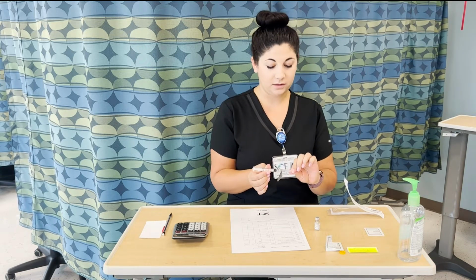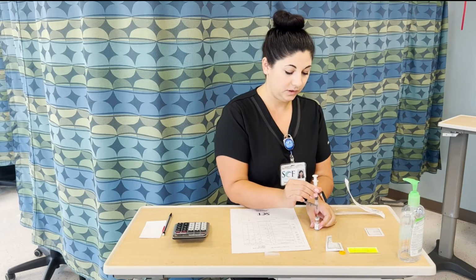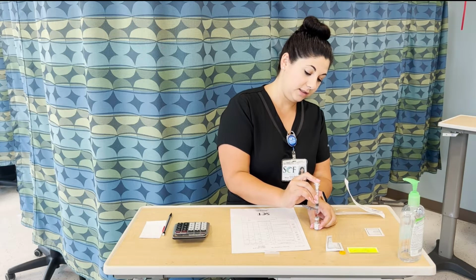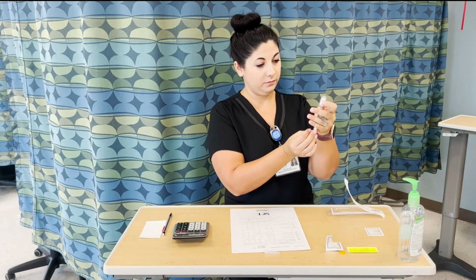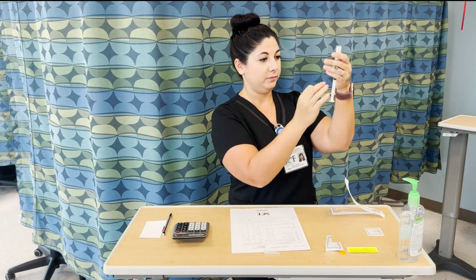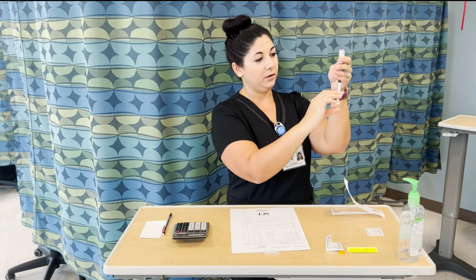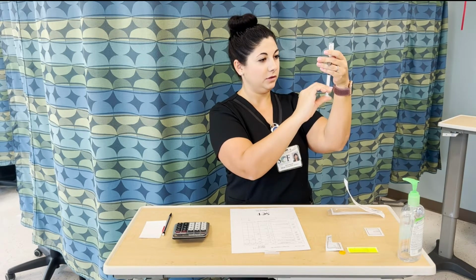Once that's dry, I can remove my cap, go straight in the middle of the vial and inject that air into the top of the vial. Then flip it over, making sure you can see your numbers, and pull up to 0.5. Check that you don't have any air bubbles in there, and you should not be touching the inside of the plunger, just the bottom.